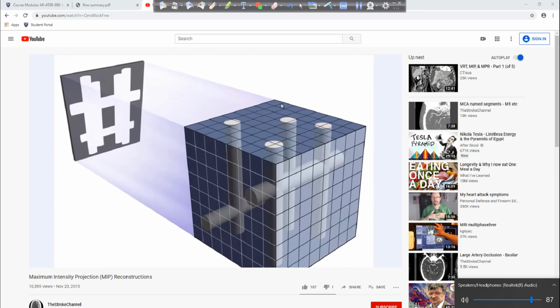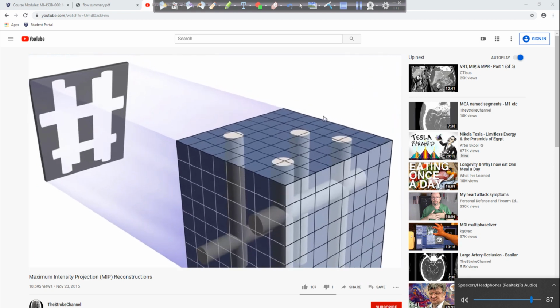In this case, it's not very bright. It's the background intensity of the brain, and so it's a darker pixel in our 2D representation. On this z-axis, at this xy position, we have two voxels that have bright information. Usually one of them will come out ahead and be the maximum intensity, presumably this voxel right here, and that gets represented in our two-dimensional slice.